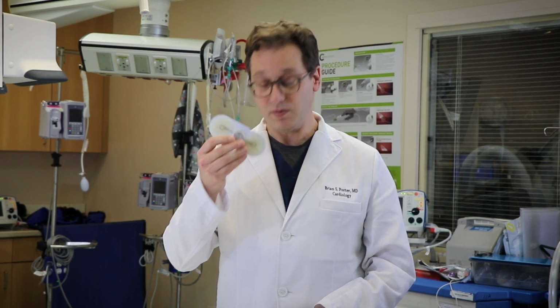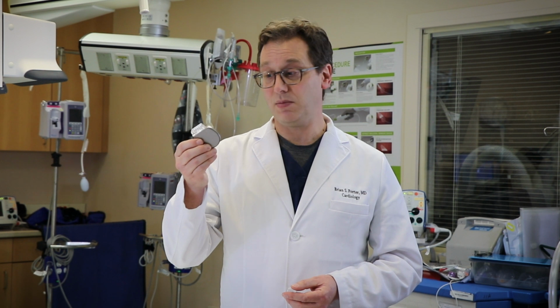So in summary, I've talked about a few of the different electrical devices and electrical testing that we can offer patients here at Exeter Hospital to treat heart disease. We talked about the patch monitor, which can be used to assess for any electrical problems that you might be having on a short-term basis. We also talked about the implantable loop recorder that can be inserted under the skin to look for longer-term rhythm problems with a patient. We also talked about implantation of a pacemaker, which is very helpful if someone's heart is beating too slowly. And if someone's heart is beating so rapidly that they're at risk for a lethal arrhythmia, we will even sometimes offer an implantable cardioverter defibrillator.